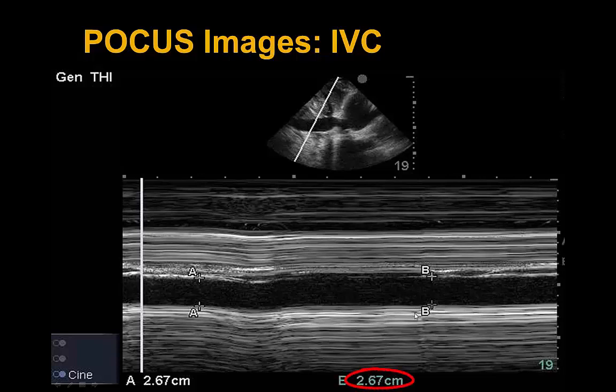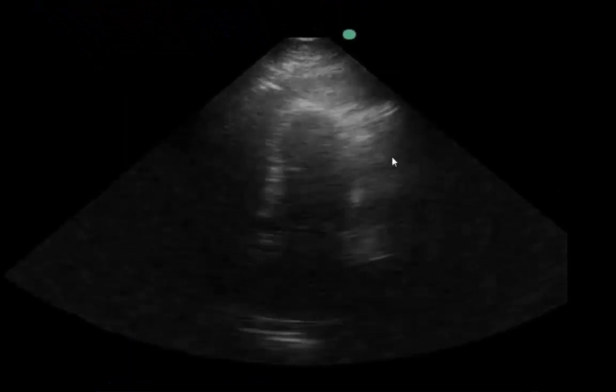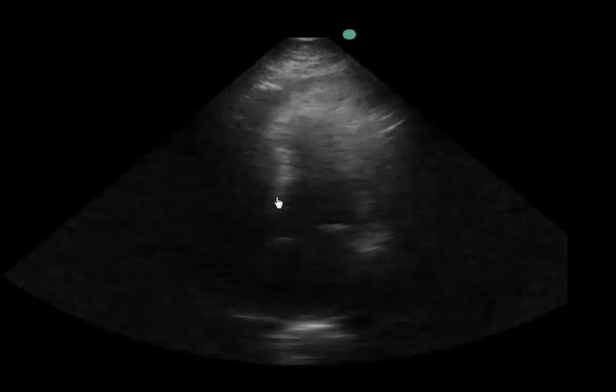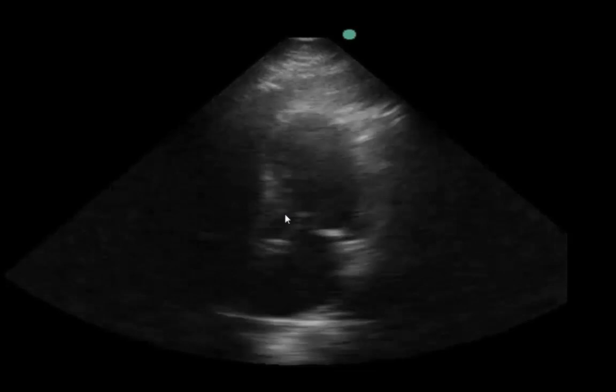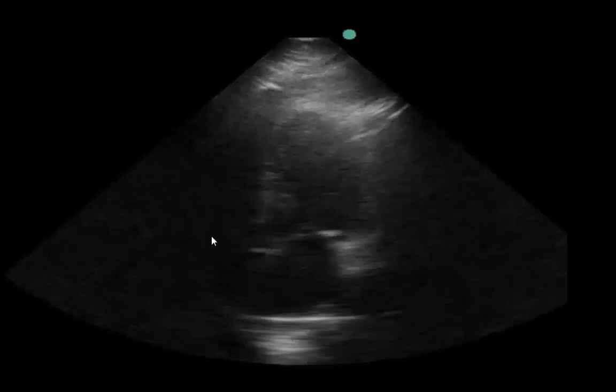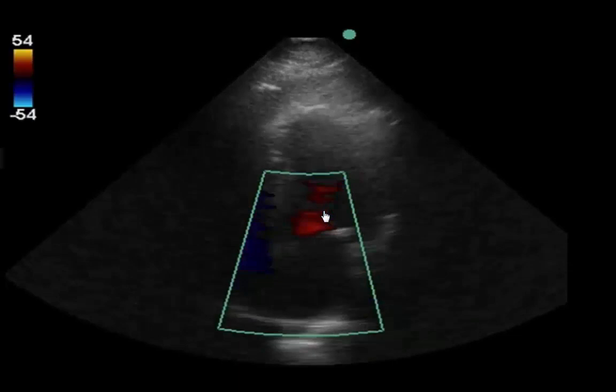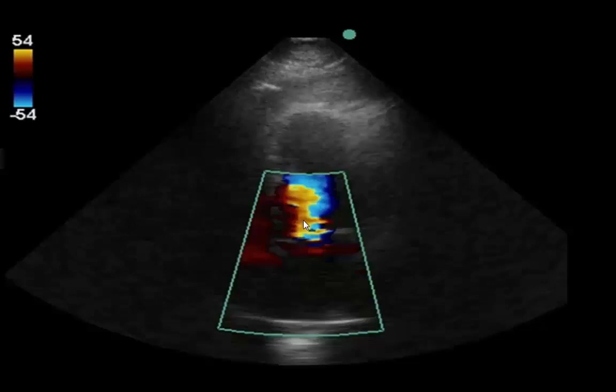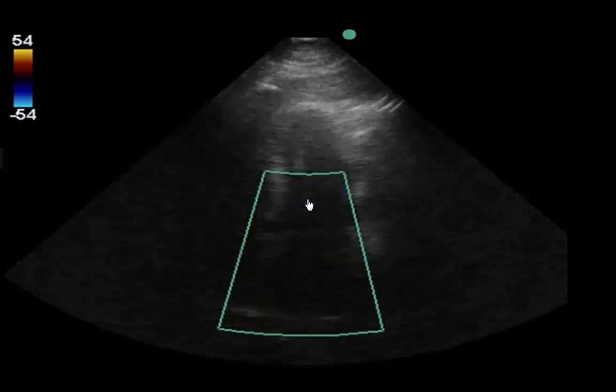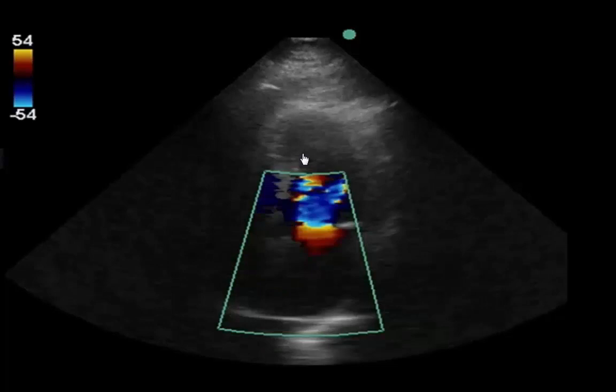Moving to the apical views, the left ventricle still appears hyperdynamic. We have a fleeting apical 4- to 5-chamber view with a look at the aortic valve and LVOT. The RV is not well seen here but was confirmed hyperdynamic in subcostal view. Throwing color across shows significant aliasing within the ventricle indicating high flows. There is no aortic insufficiency and no obvious MR in these views, though MR was seen in other views.